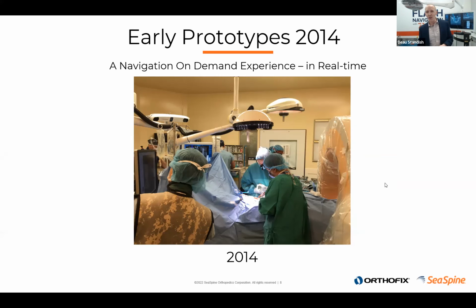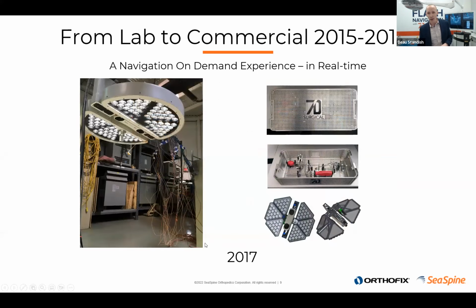Once we started to get to a manufacturable product, it took just over 2 years. And it's really amazing the success and the excitement you have of, wow, it worked in 2014 on a patient, but an academic prototype is so different than what's required to just turn on and work every day in an operating room for 5, 6, 7 years, day in, day out, with an efficient workflow that can also be manufactured at a cost that makes the product profitable.